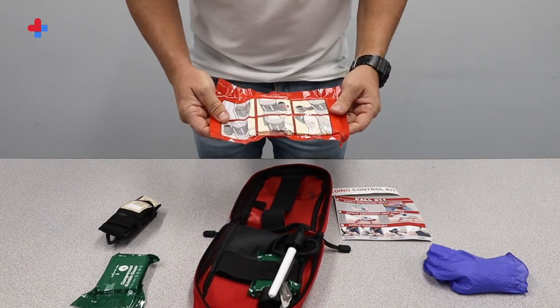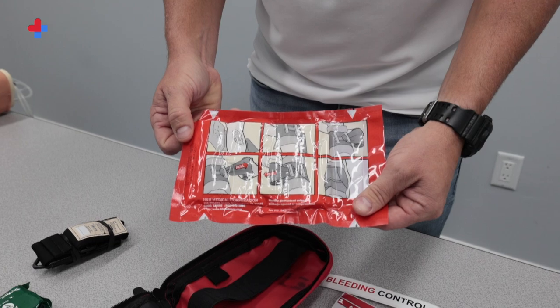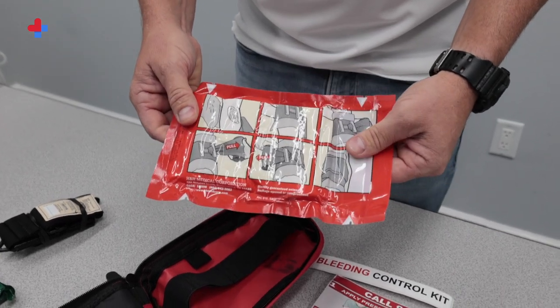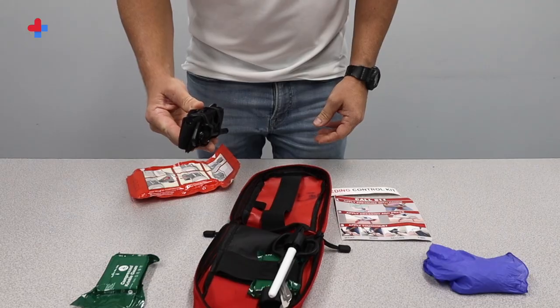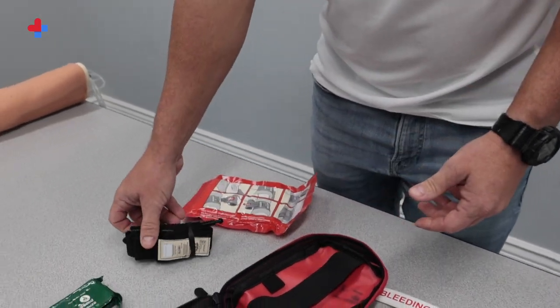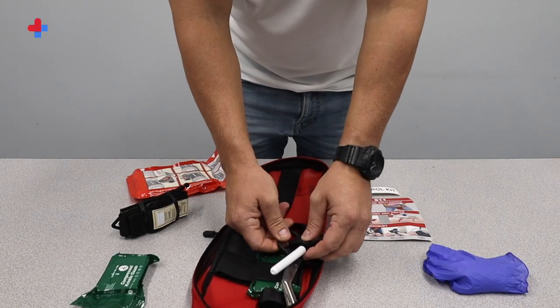The USA Hockey Kit contains a thin H bandage, a combined absorbent ABD pad, and compression dressing specifically for rapidly stopping bleeding at the site of the injury. The tourniquet is for the immediate treatment of severe extremity bleeding such as an arm or leg. It is a safe, fast, and effective way to stop bleeding.